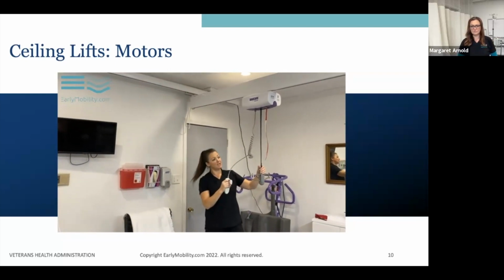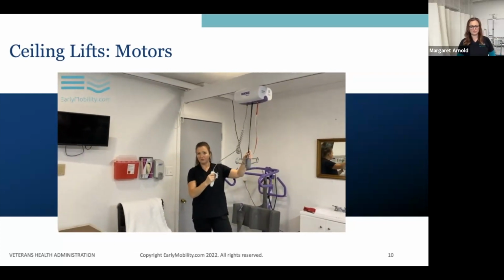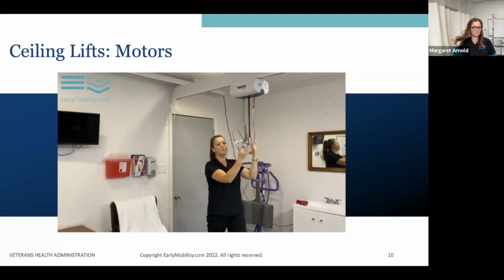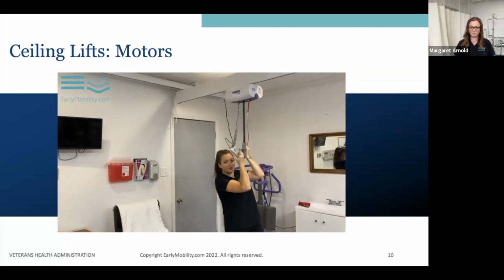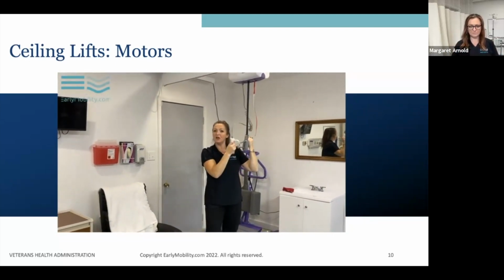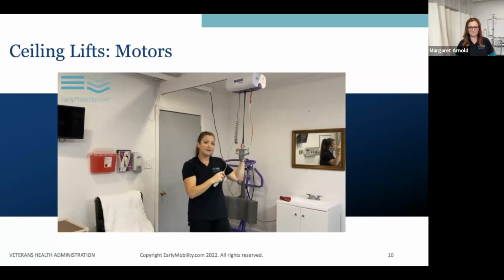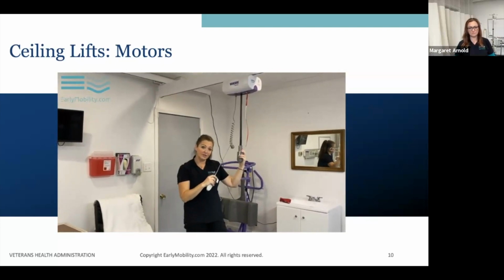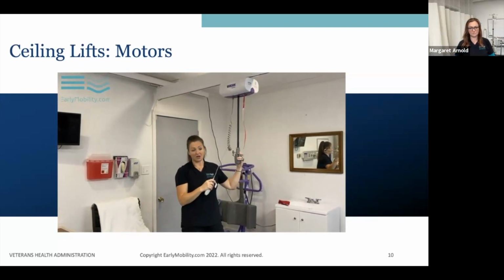Often people will check the lift goes up and down with the button without a load, but if the battery is real low, when you add a load, and you can do this just by holding it, if the lift does not lift you up easily, and if it makes a straining noise when it is loaded, you know that the battery needs to be charged.